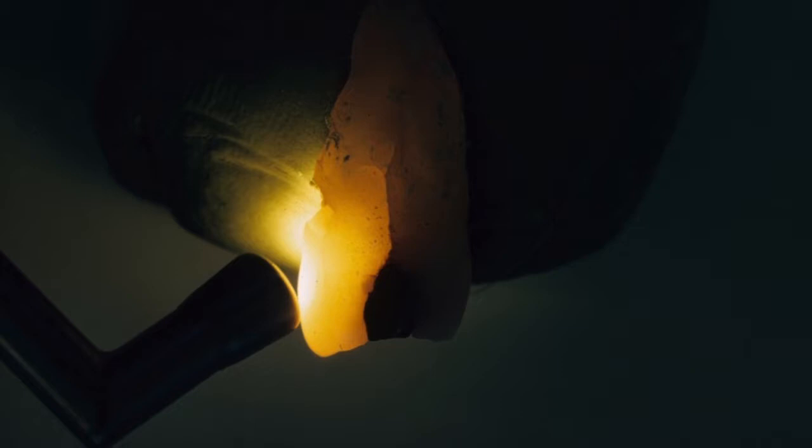It is important to vary the angulation of the light and the intensity of the light to better evaluate the extent of light transmission or the lack thereof when you see a crack. This again illustrates the stoppage of light transmission at the crack interface. Another example.